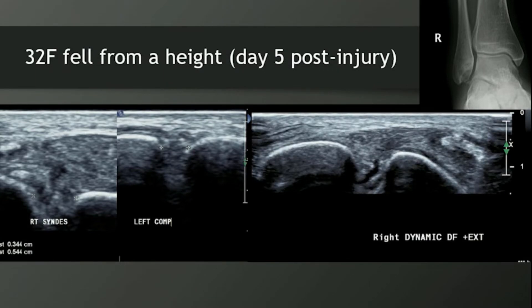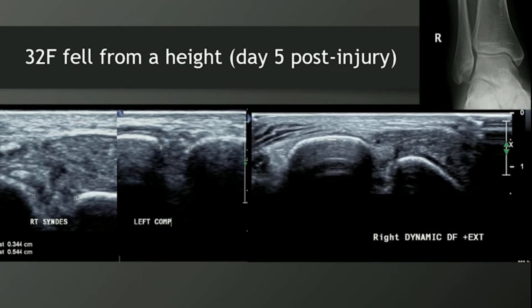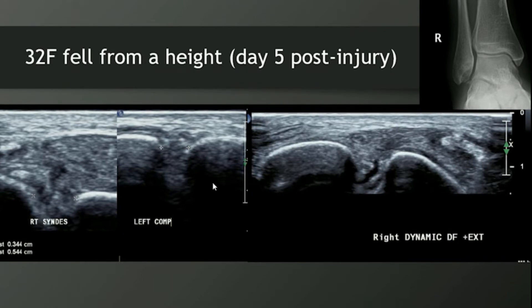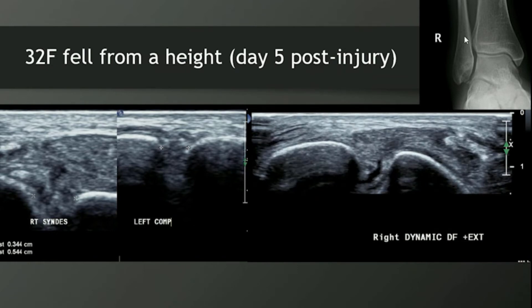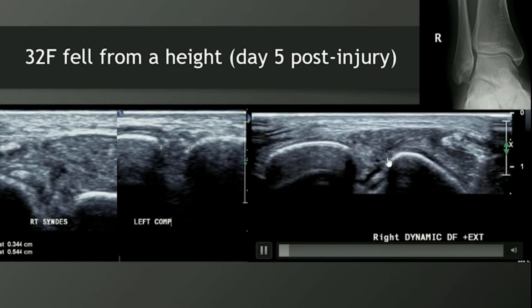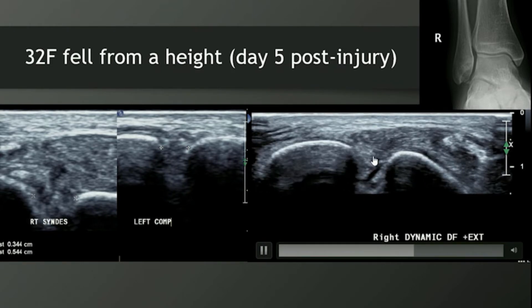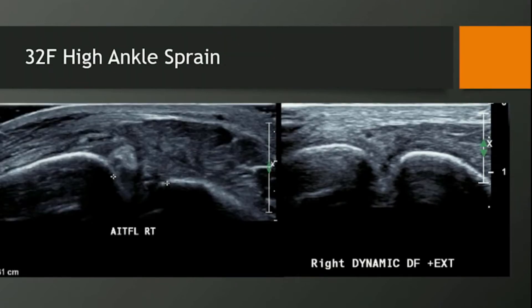This is a 32-year-old. Interestingly, she's married to a physio, so I thought she got good care there. You can see on her x-ray there's insufficient overlap of the tibia and the fibula. And again, with dynamic dorsiflexion and external rotation we can see the joint widening. It's nice to compare — I always repeat this on the normal ankle as well.